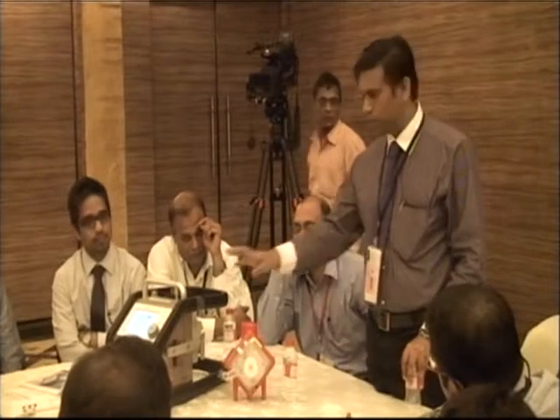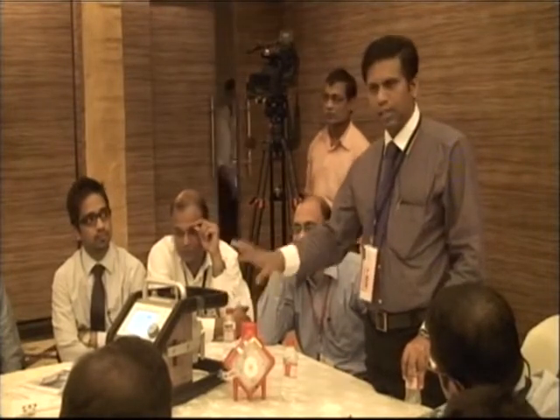Primarily, this has been widely used after cardiac surgery. Patients with transposition of great vessels with intact ventricular septum, if these patients come to us at 2 months of age, the left ventricle is already deconditioned. We do an arterial switch operation, but the left ventricle is not able to support the systemic circulation. If the patient is not able to wean off from cardiopulmonary bypass, what we do is we put the patient on ECMO.